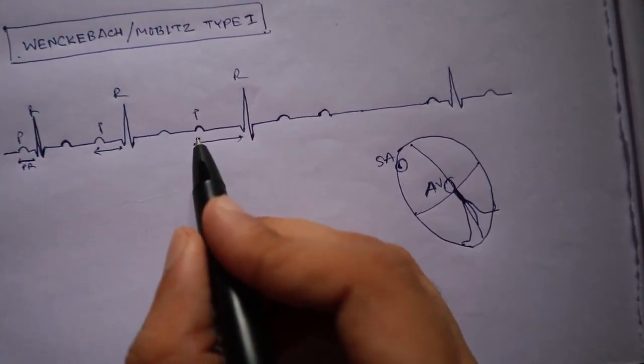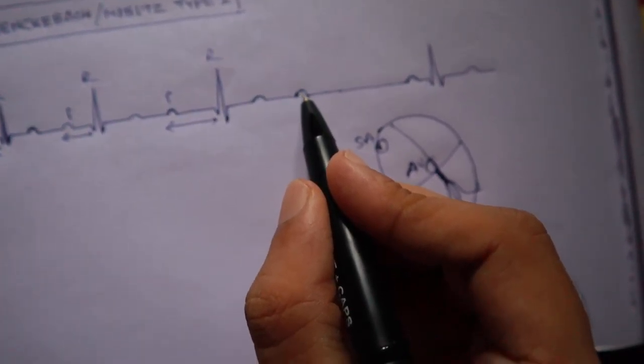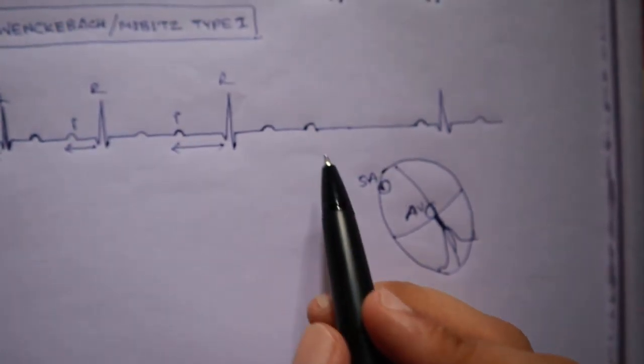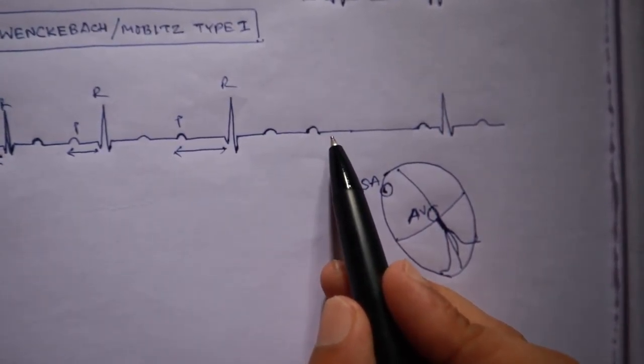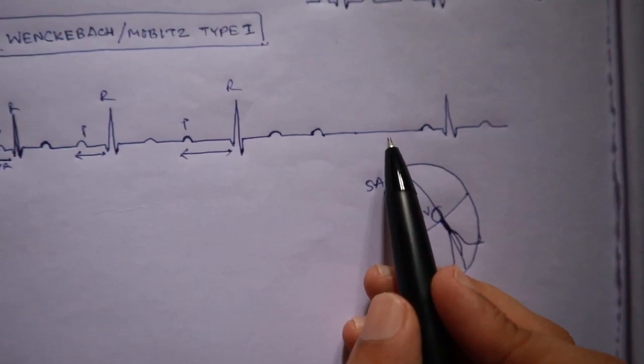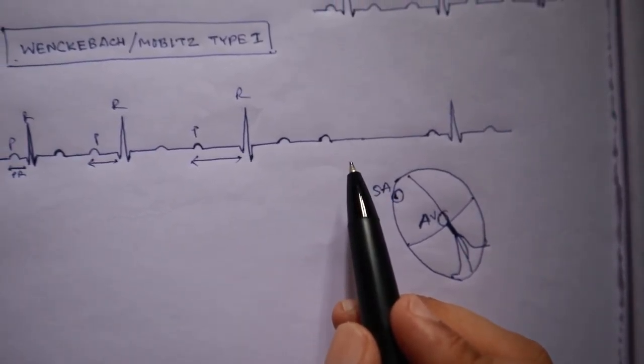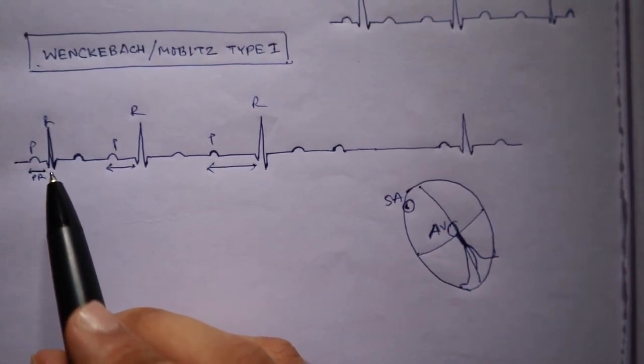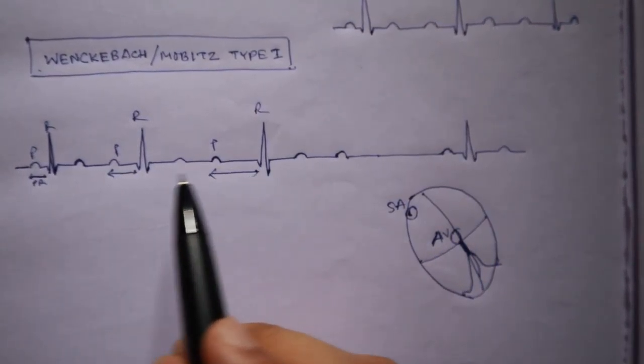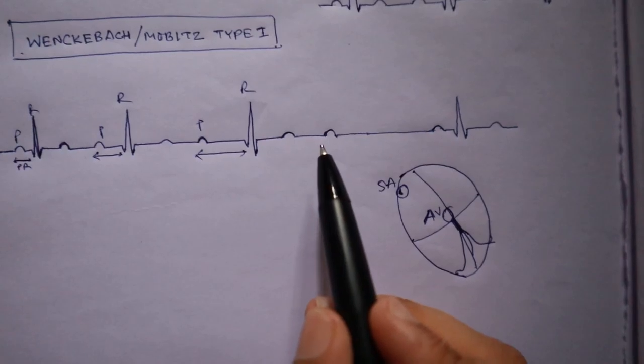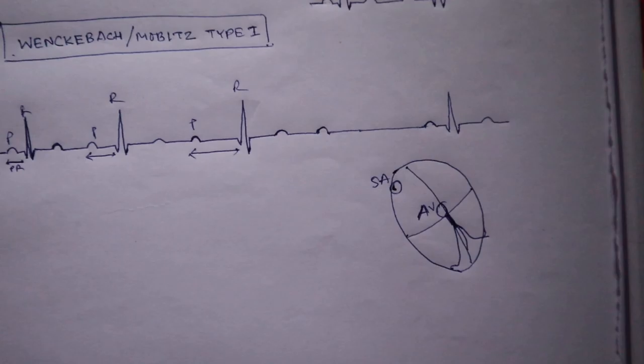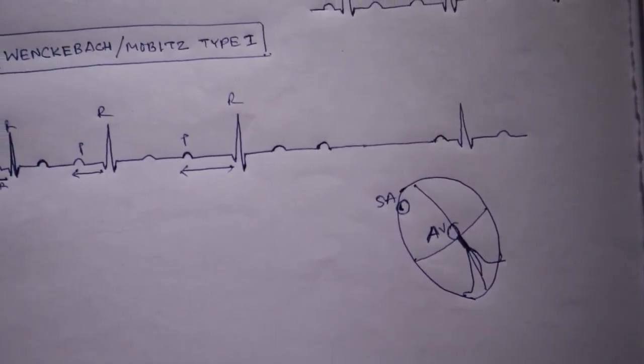And suddenly one QRS complex is missing. So this P wave that we can see is not conducting to the ventricle. This is Wenckebach phenomena, where the characteristic feature is progressive lengthening of the PR interval and one QRS complex consequently misses due to the AV block. This is Wenckebach or Mobitz type 1.